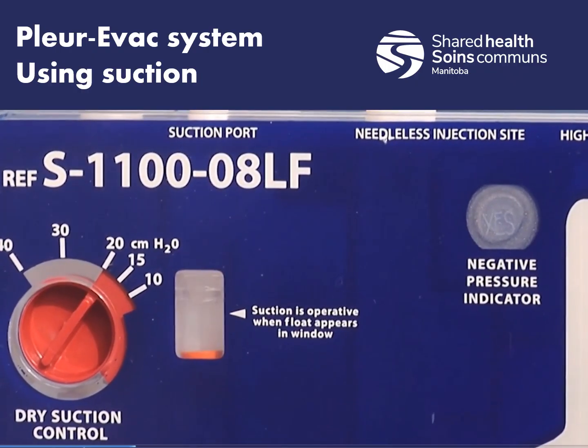Another one as well that you might see, they pointed to, is the negative pressure indicator. It should pop up and say yes. That tells you that you do have accurate suction. If that disappears as well, that means you don't have accurate suction. So if your float drops and it doesn't say yes anymore, check your suction. It's either come loose, it's not working, or there's some kind of damage to the device or the tube itself.